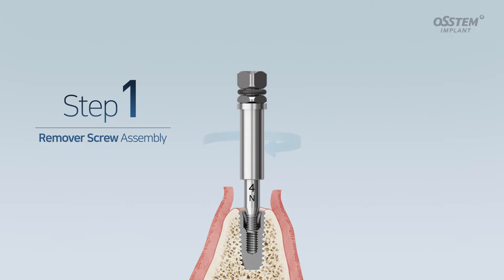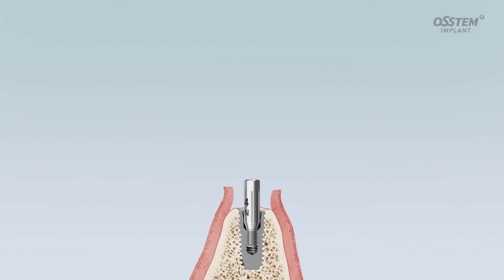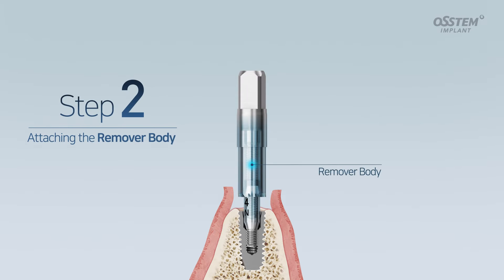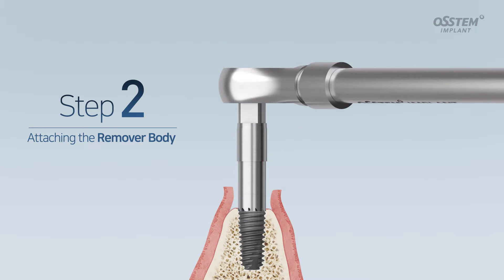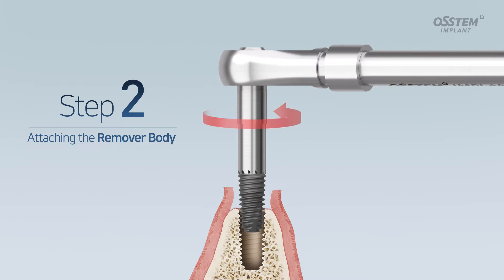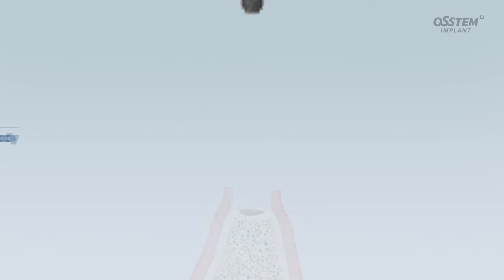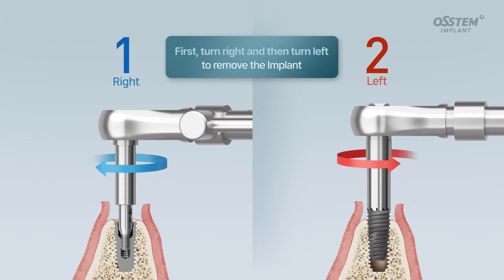Turn the remover screw clockwise with the screwdriver included in the EFR kit to fasten the remover screw. Next, turn the remover body counterclockwise to remove the implant. Turn right and then turn left to quickly and easily remove the implant.